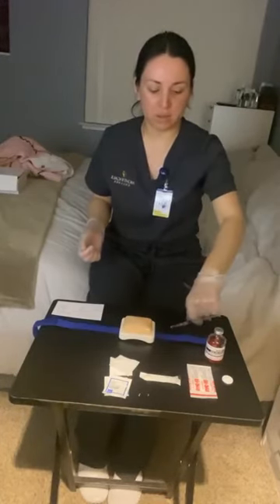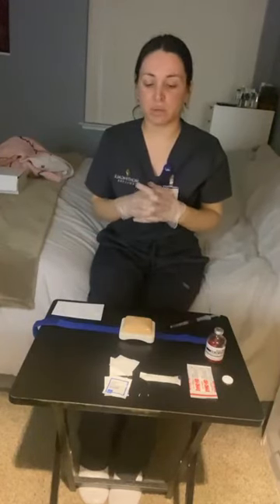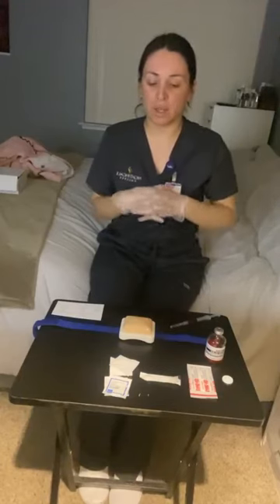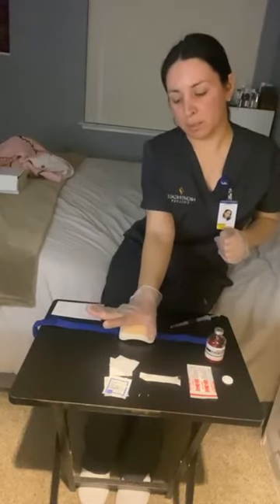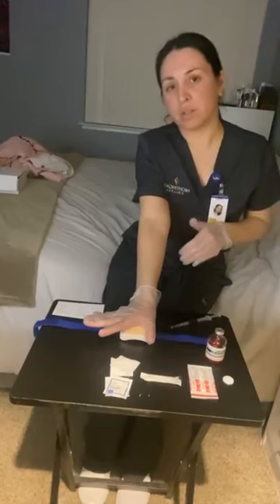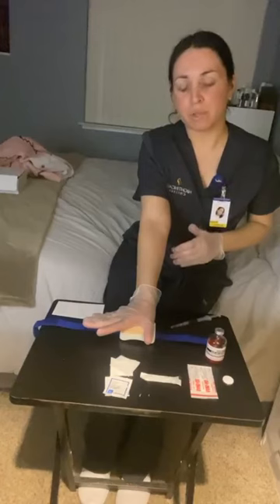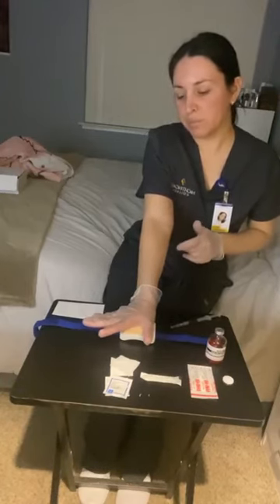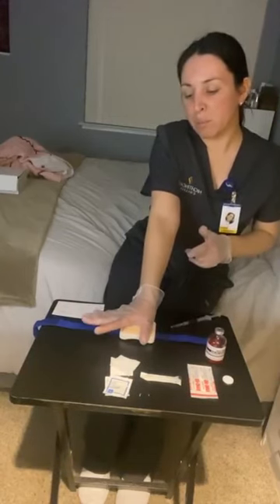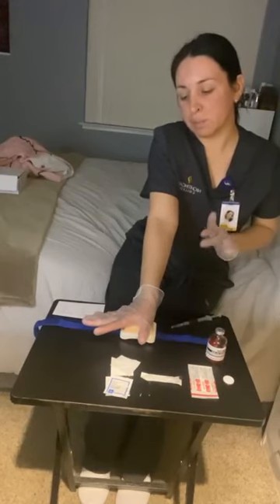Next, I'm going to locate the appropriate site. I want to use the ventrogluteal site, and to do this, I am going to place the palm of my hand, the heel of my hand, on the greater trochanter of the patient's hip, my wrist almost perpendicular to the femur. The thumb would be facing the groin of the patient. The index finger is going to be pointed along the anterior superior iliac spine.